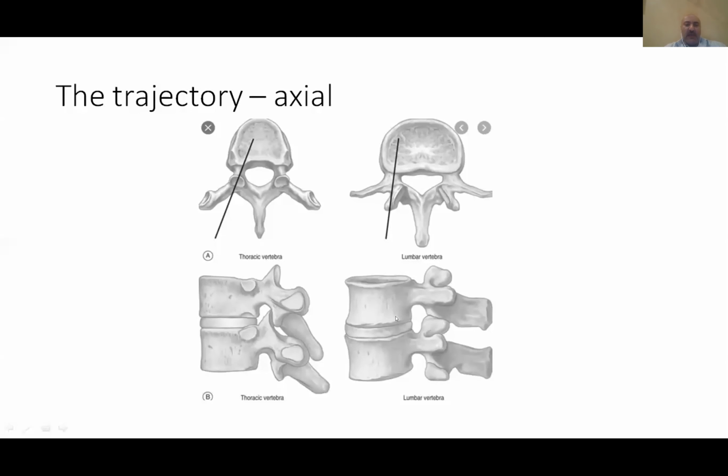It's very important. Besides that, if you see both of these, the lumbar and the thoracic vertebra, you can see here the pedicle of the thoracic is more oblique. So always try to aim from the top of the pedicle. In the middle here of the pedicle, the Jamshidi needle should pass, and then your end point has to go to the lower end corner here of the vertebra.